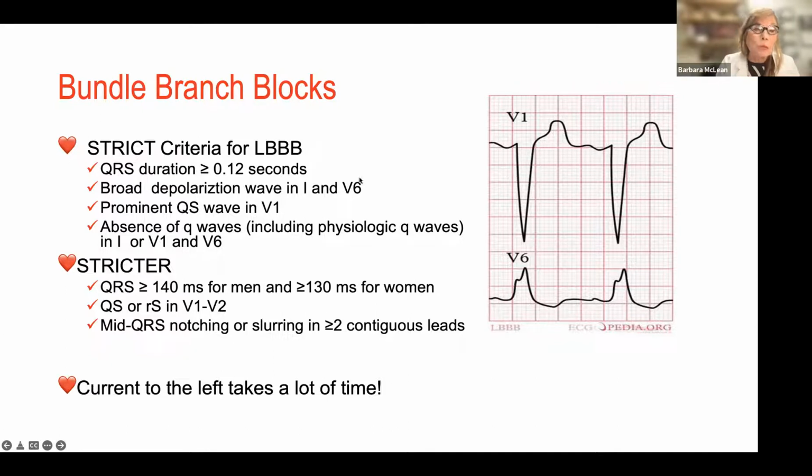This is an S wave. So really, this is not a Q because you have that tiny little R there. So this is a very deep S wave. It could be a QS wave, but this is just a deep S wave. And you don't have any Q waves in V6, which you normally do.